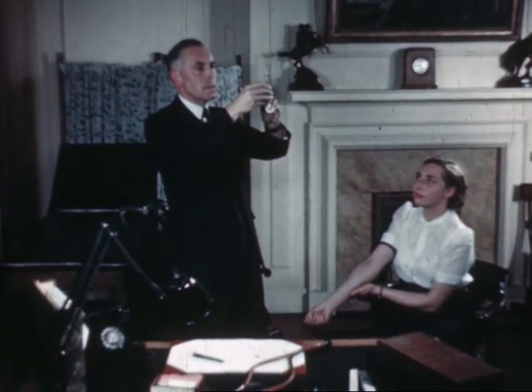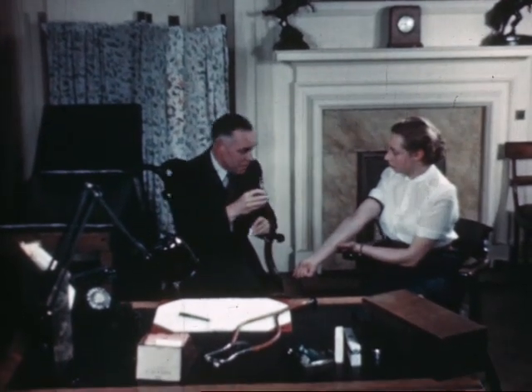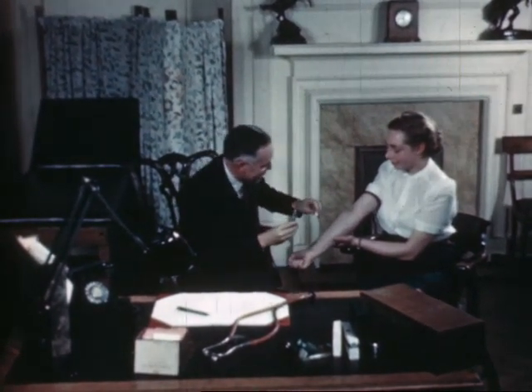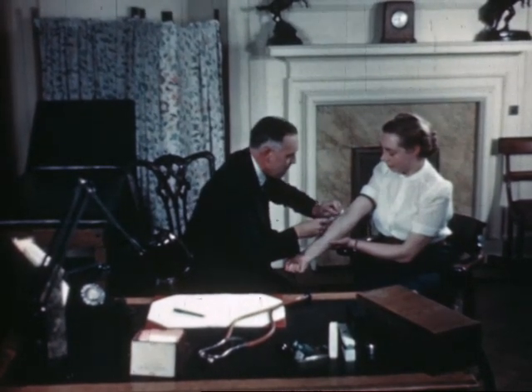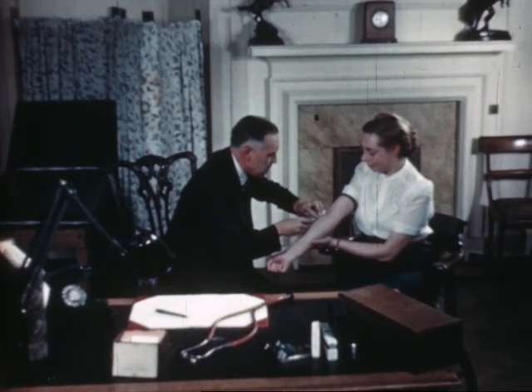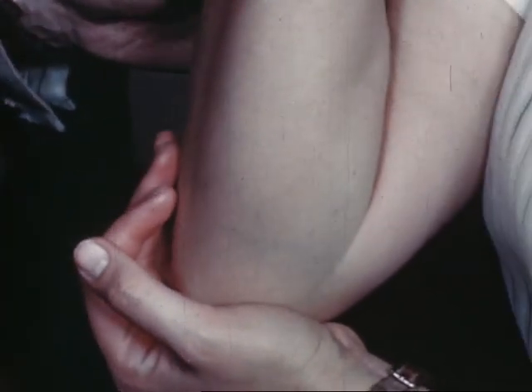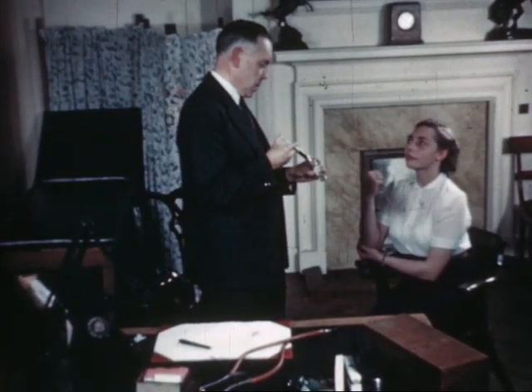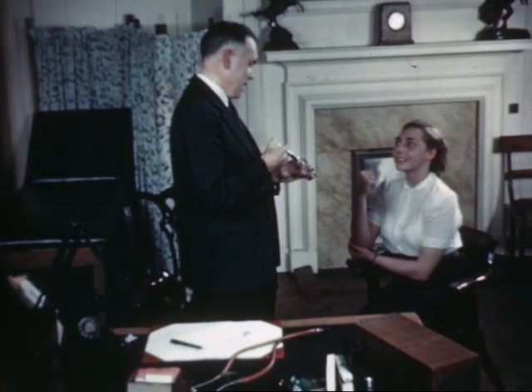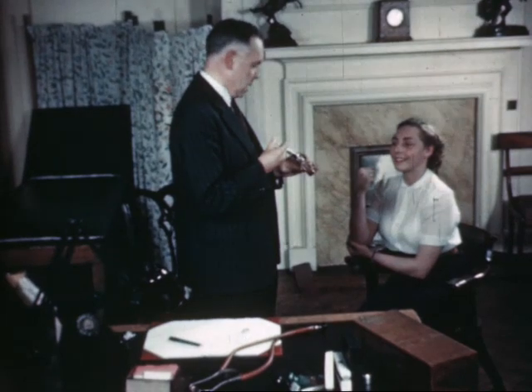Let's first take a look at a doctor at work in his consulting room. He's taking a specimen of blood to send to the path lab, and his patient, who hasn't had a venipuncture before, is naturally nervous about it. However, she's happy to find that after all it's quite painless and soon over, thanks to the professional skill of her doctor. A well-performed venipuncture gives the doctor considerable kudos with his patients.